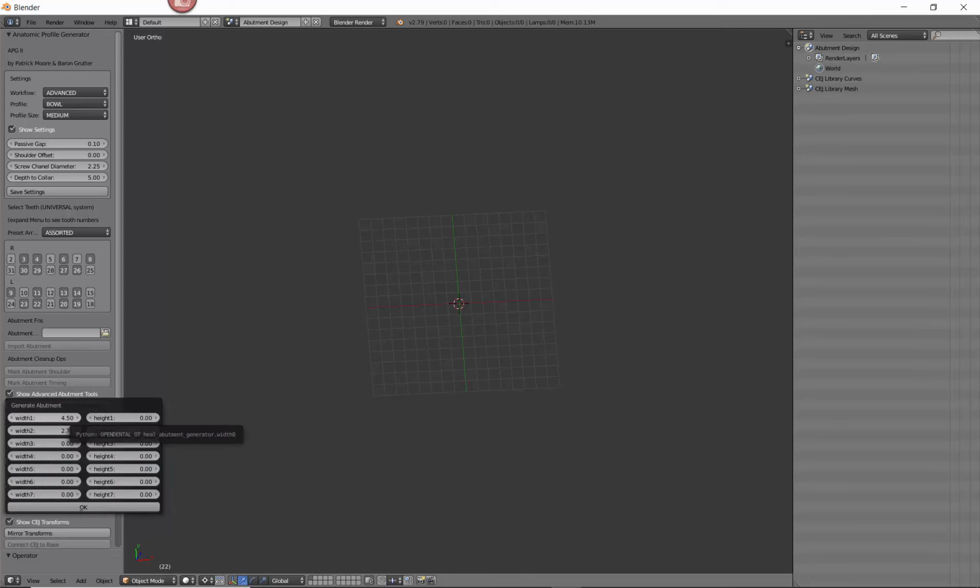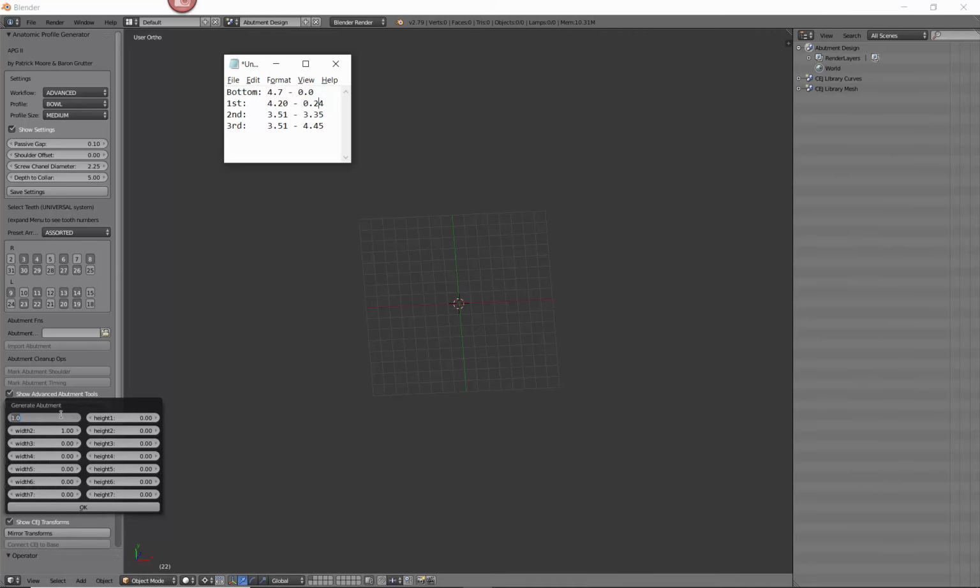Now I've already typed this in, but I'm going to go ahead and zero all these out so you can see me enter them, as unimportant as that is. It leaves it at 1 millimeter as a default. That's fine. So the bottom, we know it needs to be 4.7. Oops, I'm typing in the wrong window. Okay, so in this window right here, I'm going to put 4.7, and this one, it's at the 0 point.